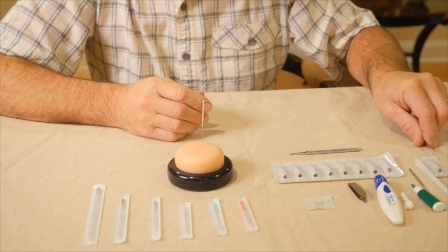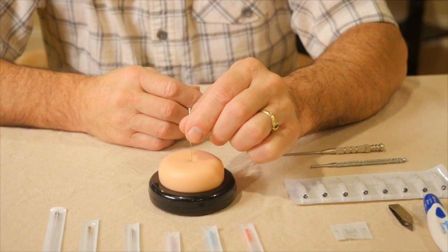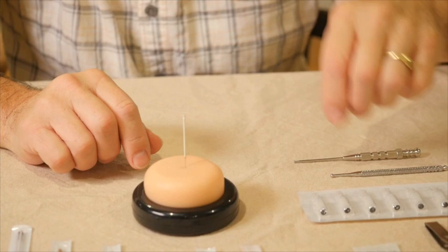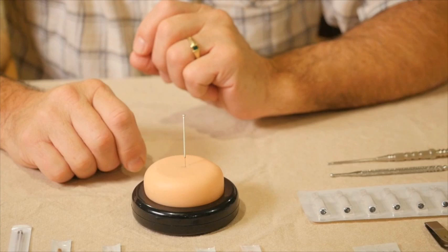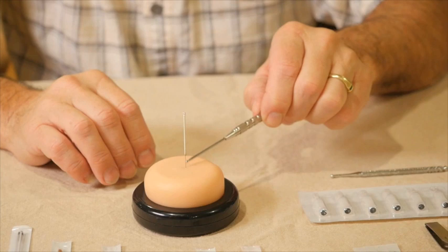When inserting acupuncture needles into the skin, we never want to insert a needle all the way up to the handle. We always need to leave some portion of the shaft visible for safety reasons. We never want to insert a needle any deeper than an eighth of an inch to a quarter of an inch, with that much of the shaft still left showing.